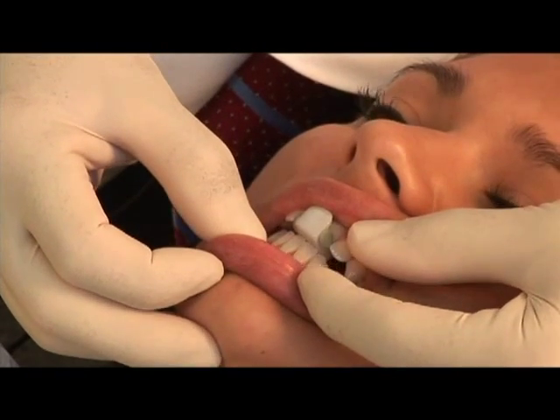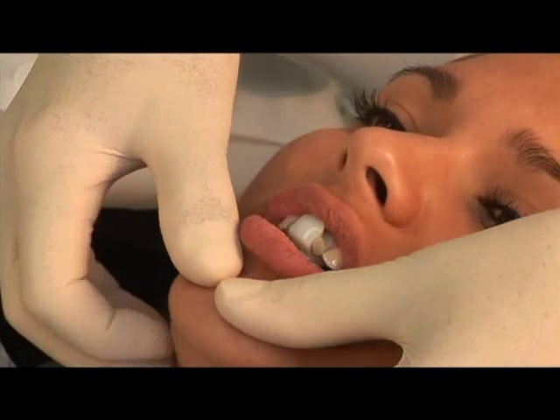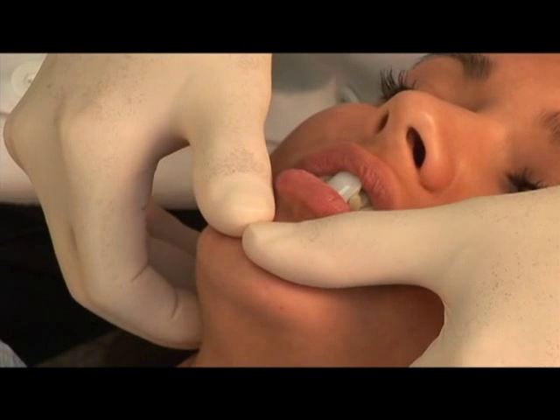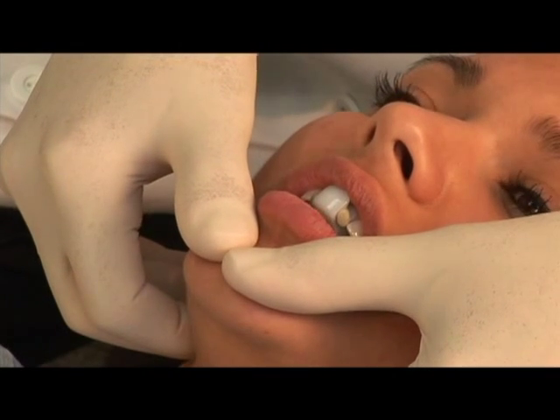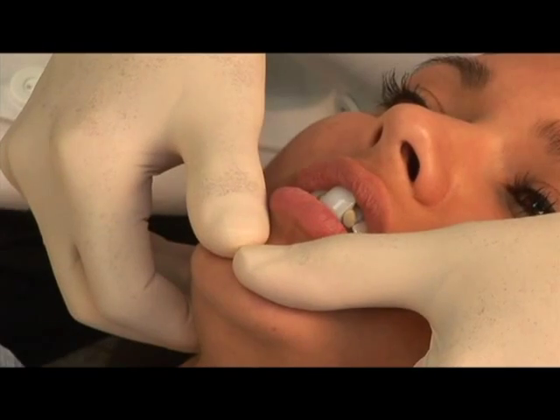We need to ensure that the patient has free movement without any posterior interferences and without any muscle interference, allowing free movement of the mandible. We then check to make sure that the condyles are fully seated before making the centric relation record.